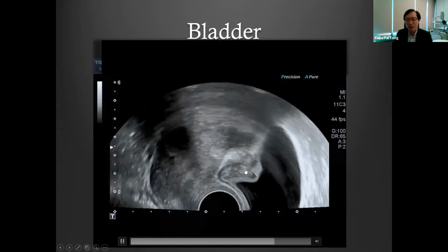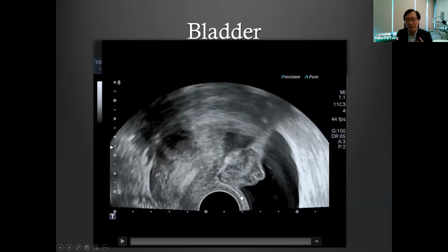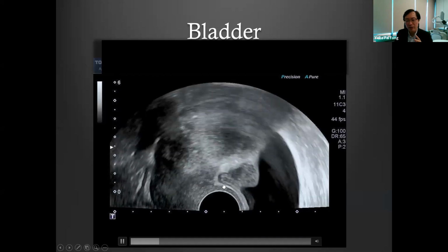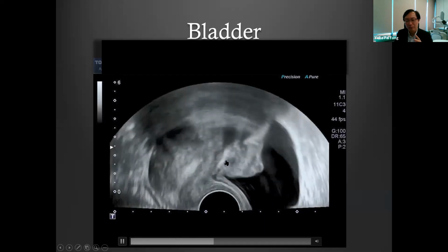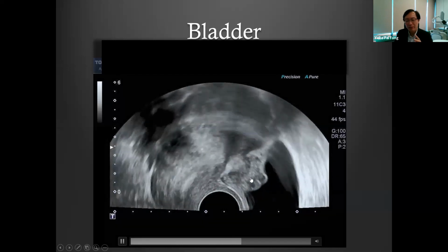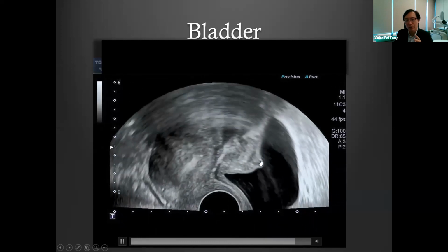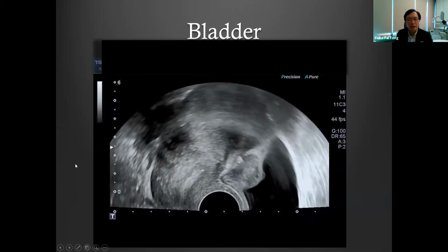You can see that the nodule is in the mucosa of the bladder. It is not an external indentation, it belongs to the bladder actually. The UV fold lower down here is actually quite mobile and quite free over here. But it's just the mid segment of the dome or the base of the bladder that's got this big nodule over here, and this is quite typical endometriosis, right?